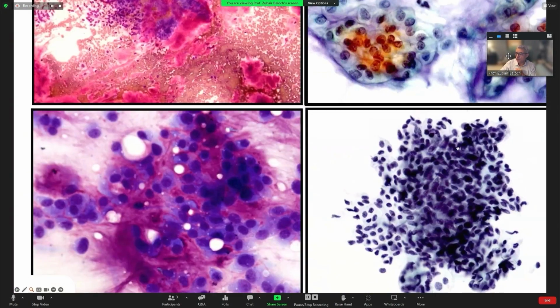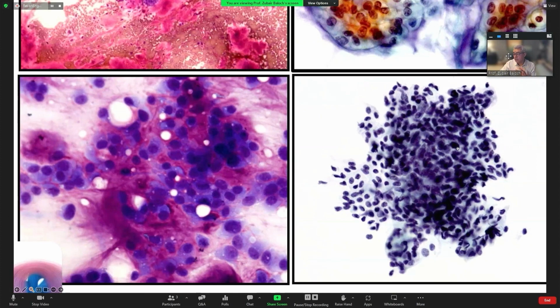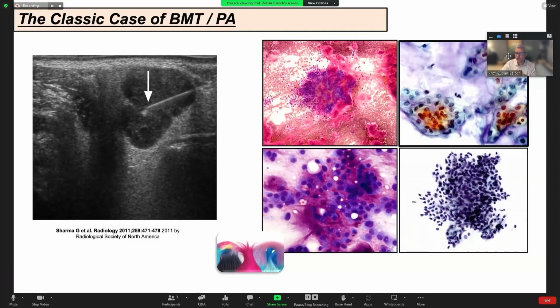Now, when you put them on thin prep, this stroma kind of goes away. This is where I had to teach myself a lot, where you can mostly see cells. You don't see that really beautiful stroma in so much amount as you see on the smear. So I really like smears on these cases. But if you look closely, you can see stroma in this. This type of stroma with the frayed edges, or edges with a feathery appearance, is called the troll hair stroma that everybody uses.